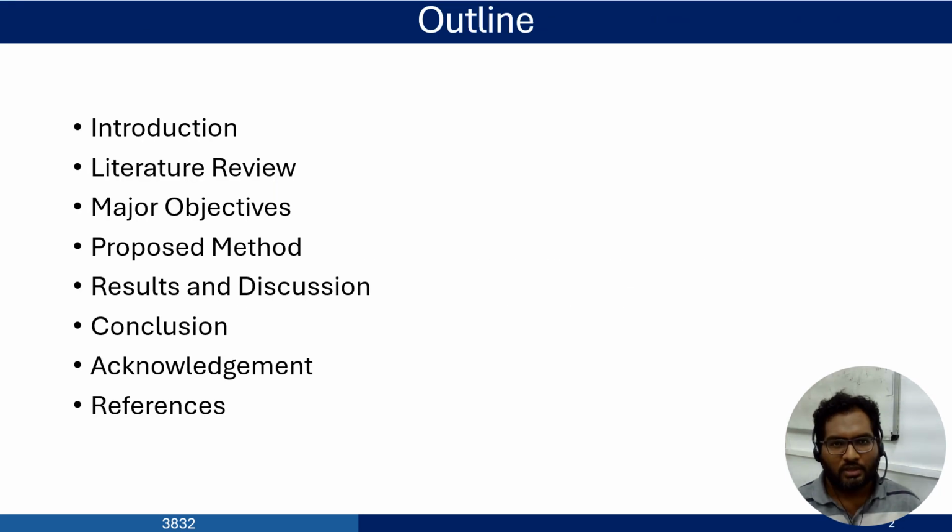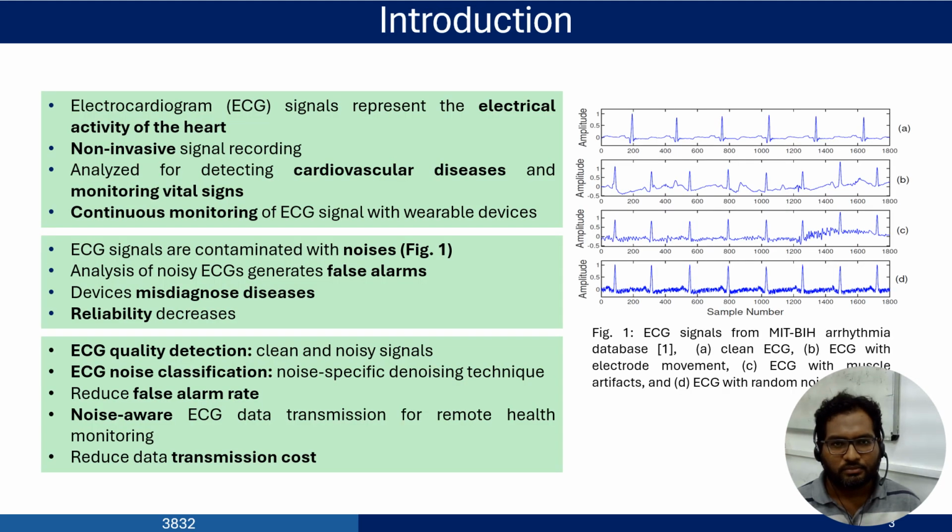The outline of my work includes introduction, literature review, major objective, proposed method, results and discussion, conclusion, acknowledgement, and finally references. ECG signals represent the electrical activity of the heart, which can be recorded non-invasively and are analyzed for cardiovascular disease detection and monitoring vital signs.